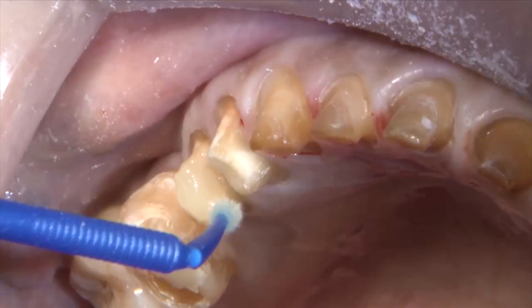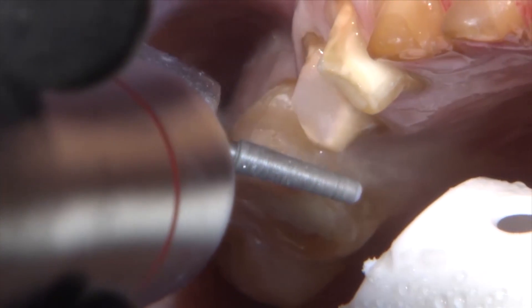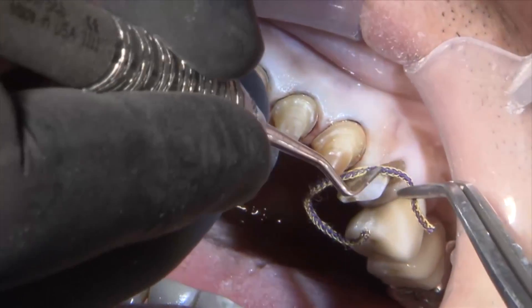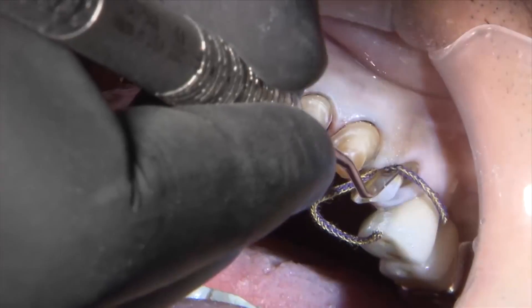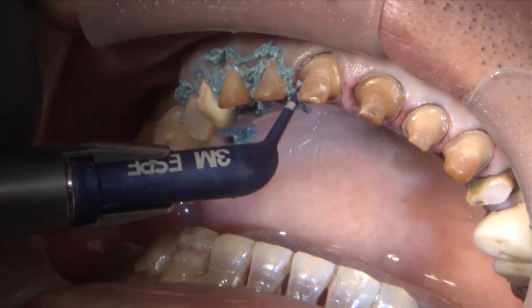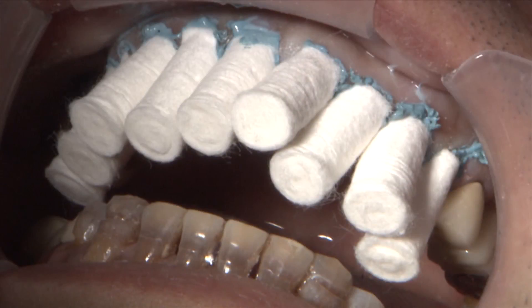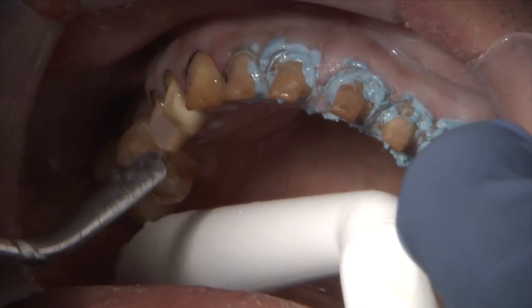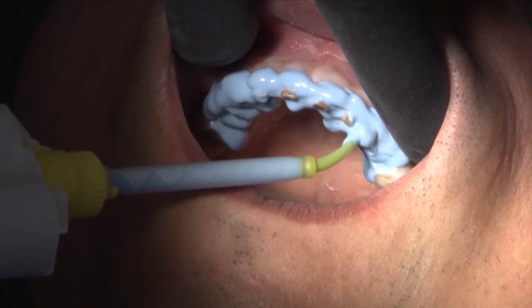Using some light-cure composite to get an ideal prep. When you work on dental technicians such as this gentleman, they will always look at their models afterwards and want to know why a prep doesn't look perfect, so you end up making sure that you're able to go in and build up anything that needs to be built up — it's in the best long-term interest of the tooth and the restorations as well. So we're going to put that double-zero cord from Ultra Pack around all those teeth, and then the retraction capsule from 3M ESPE around all those teeth with some anatomic copper caps, have the patient bite down for eight to ten minutes.